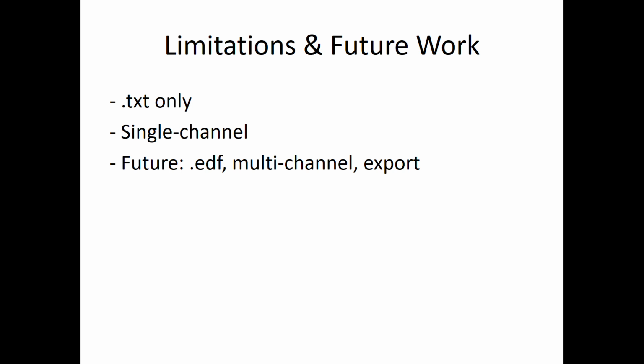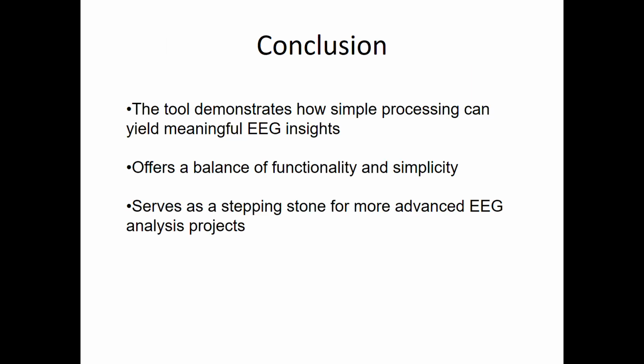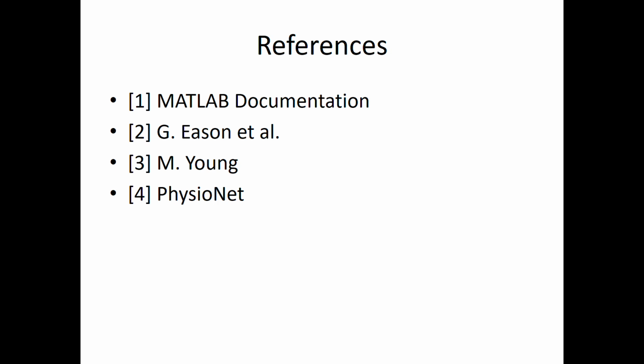So looking ahead, future versions could support more data formats, offer exportable results, or allow side-by-side channel comparisons. To conclude, this project shows that even simple signal processing techniques, when integrated with a user-focused design, can make EEG analysis accessible and informative. Thank you for listening.